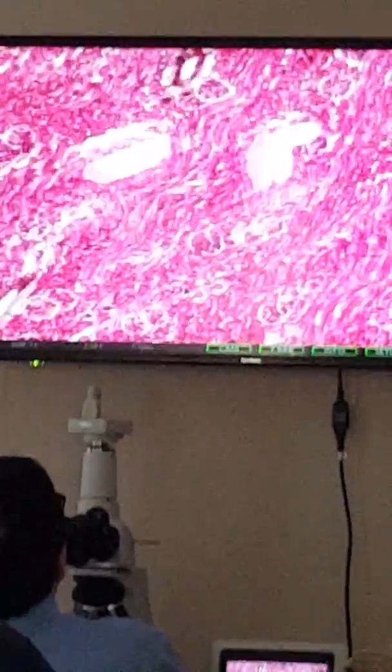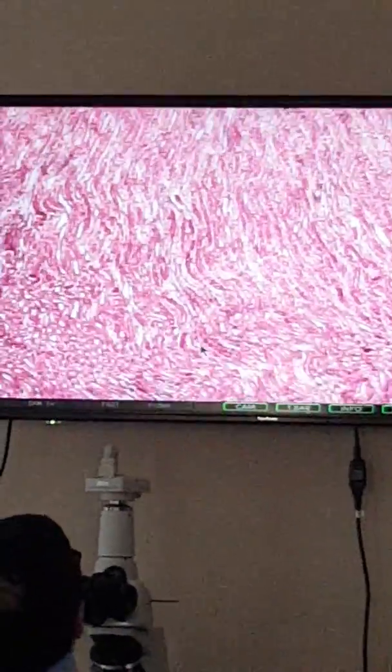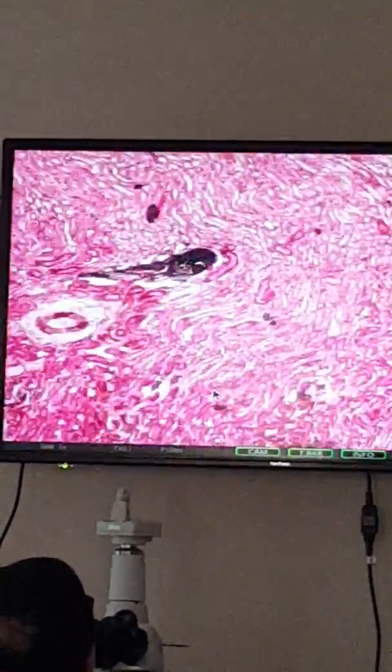And what do we call this? Well, we have the glomerulus, and if you include the capsule around it, that's called the Bowman's capsule. What do we call the entire structure now? A renal corpuscle. Okay? So, what part of the kidney are we looking at when we see renal corpuscles? The cortex, yeah. If we go down deeper, look here, no corpuscles, no glomeruli. So this has to be the medulla.